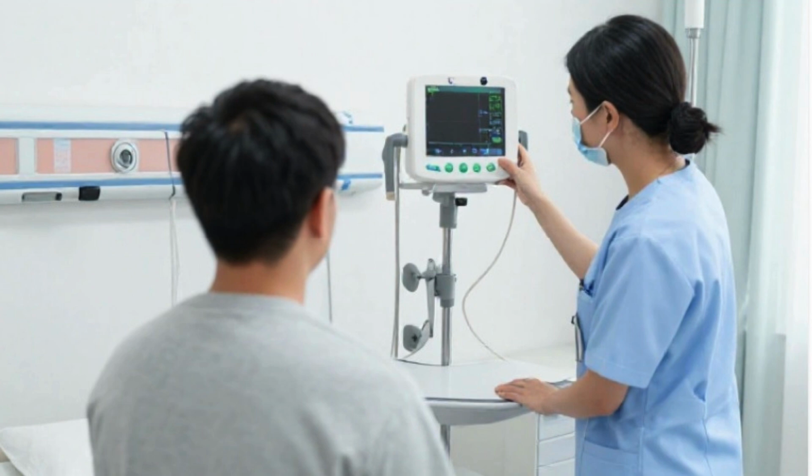Patient monitoring systems can be classified into bedside monitors and central monitoring systems. Bedside monitors are located near the patient's bed and provide direct monitoring. Central monitoring systems collect data from multiple bedside monitors and display it at a central station, allowing nurses and doctors to observe several patients simultaneously.